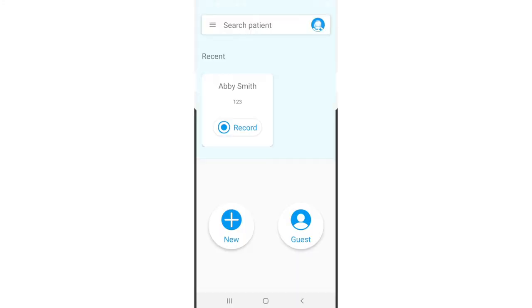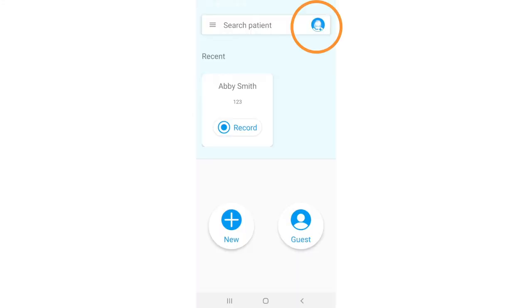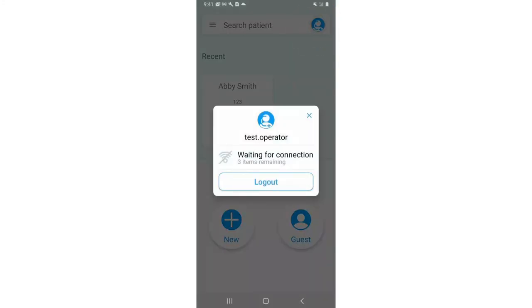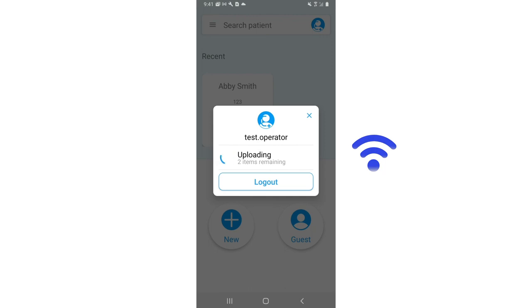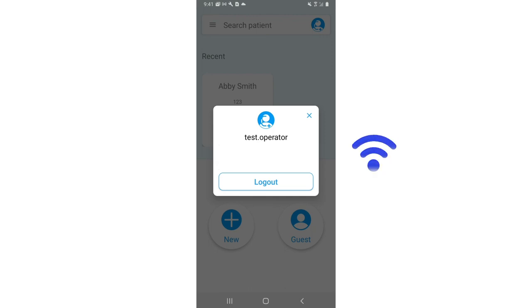In the main view, press the icon on the upper right-hand corner. The pop-up window will display the number of items remaining that still need to be uploaded. The app will automatically upload the recordings once the internet is connected.